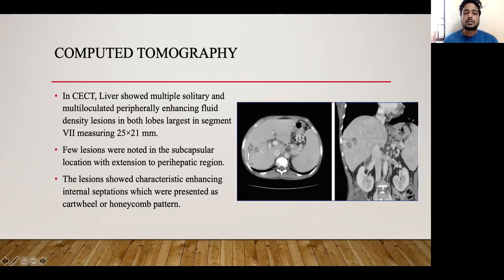The patient was taken up for CECT, which showed multiple solitary and multi-loculated peripherally enhancing fluid-density lesions in both lobes of the liver, with the largest in segment 7 measuring 25 by 21 mm. A few lesions were in subcapsular location with extension to the perihepatic space. The lesions showed characteristic enhancing internal septations presenting as a cartwheel or honeycomb pattern, as seen in these images.